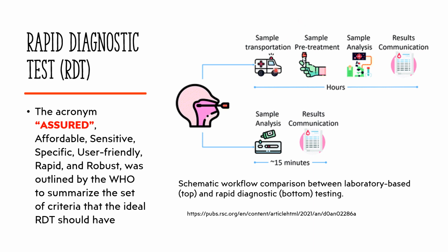Rapid diagnostic tests. Samples are analyzed directly at the point of care, which can be a doctor's office or clinic, using simple devices like test strips or cartridges. Results are typically available within minutes to half an hour.